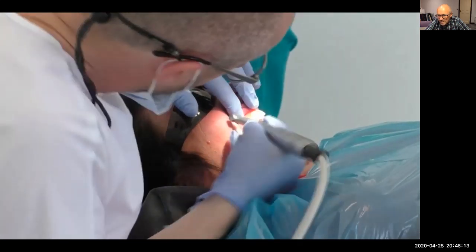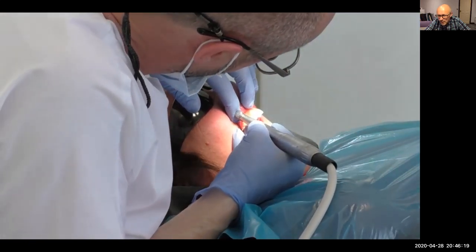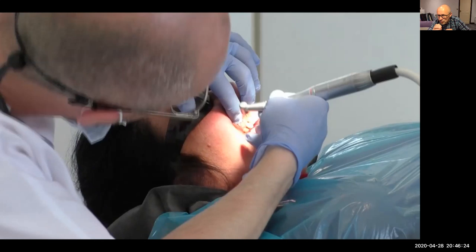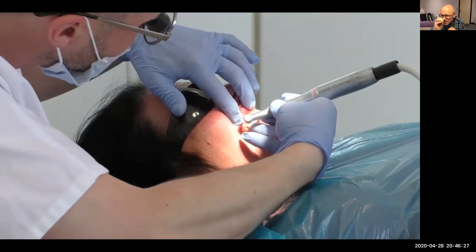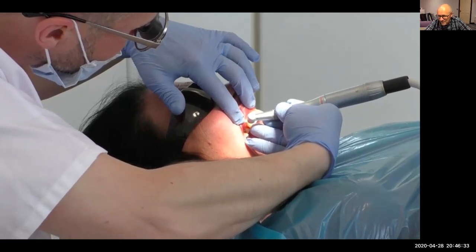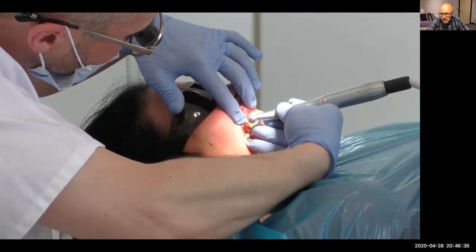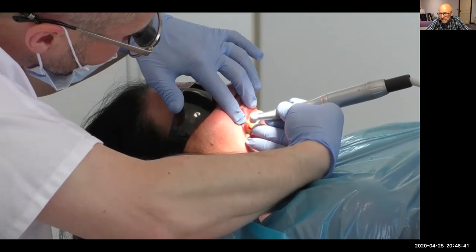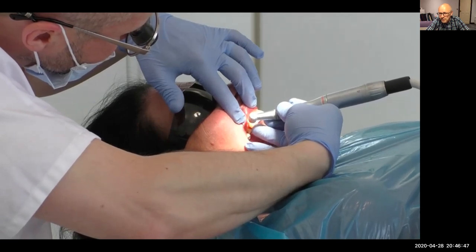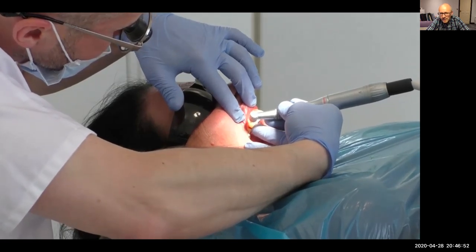I had a patient waiting in the lounge outside. But I had to cut it out using my diamond crown prep burr just to cut around that flange to get it out. You can see my cheeks going red. I'm really stressed. Diane was fine about it though. She's absolutely fine. But seriously, I don't want to scare you about this at all. As long as you move it in and out, it's absolutely fine. It works fine. Just follow the manufacturer's instructions.